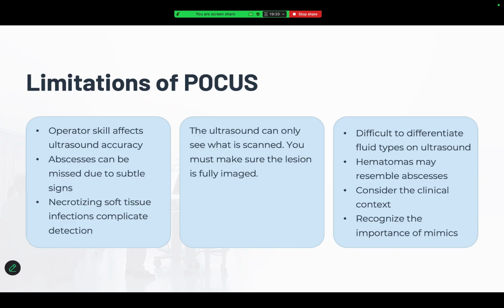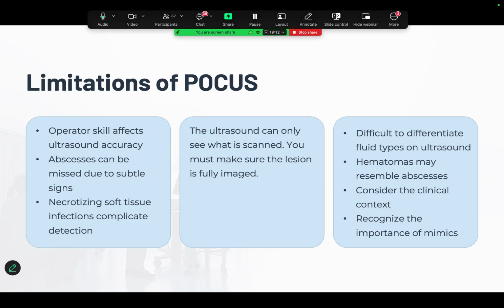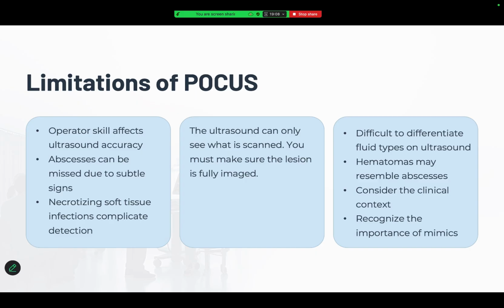With all these good things that we discussed about the ultrasound, our friend the POCUS has some limitations. It is really dependent on who is doing the ultrasound. It's operator dependent. So that's why we need to learn and to practice to improve our skills to be the most efficient physician using the POCUS. If you are not that skilled and you trust your study, you may miss something. That's why you need to practice and to review your images with someone more expert than you.